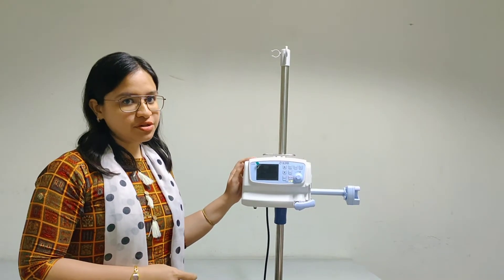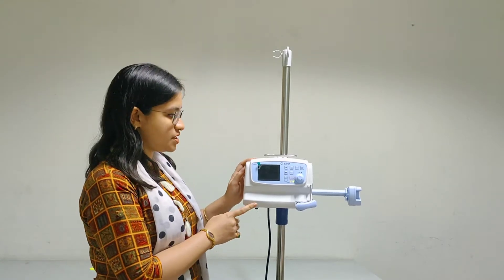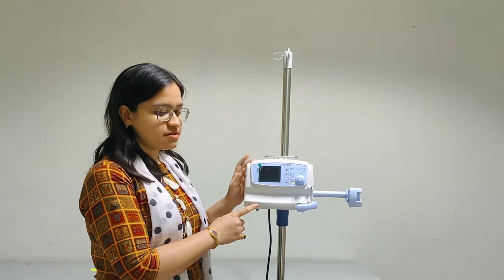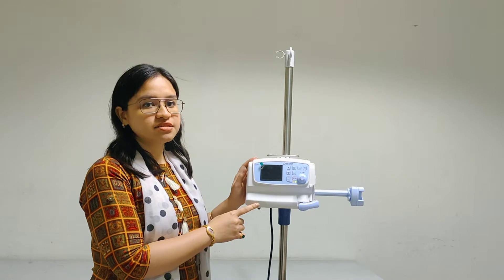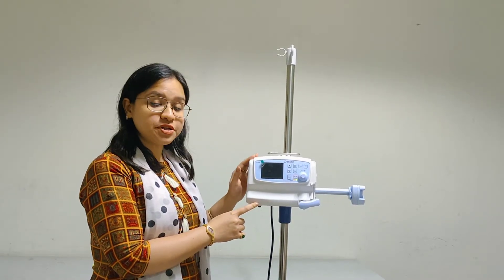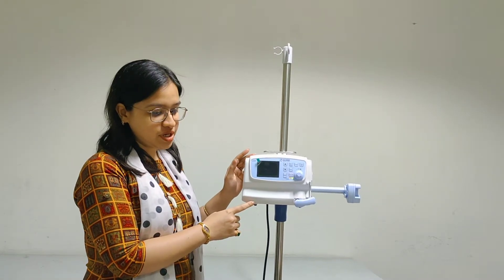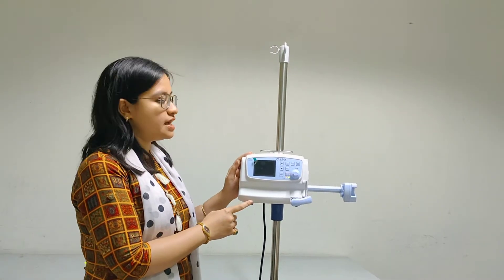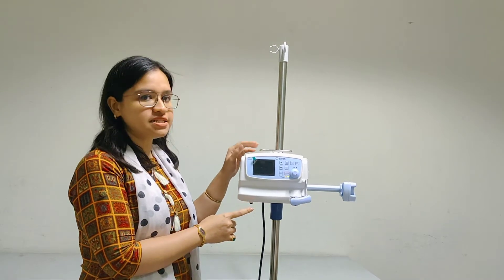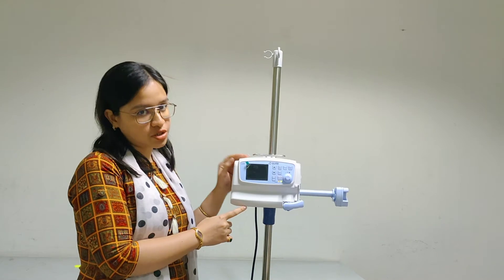Today we will have a demonstration of the Luna syringe pump. We have an IDIC make Luna syringe pump here. This is a front-loading syringe pump and it is very easy to use. You can operate it with battery as well as mains, and the battery is rechargeable. As you can see, this is a multi-stackable syringe pump — you can use many syringe pumps together.